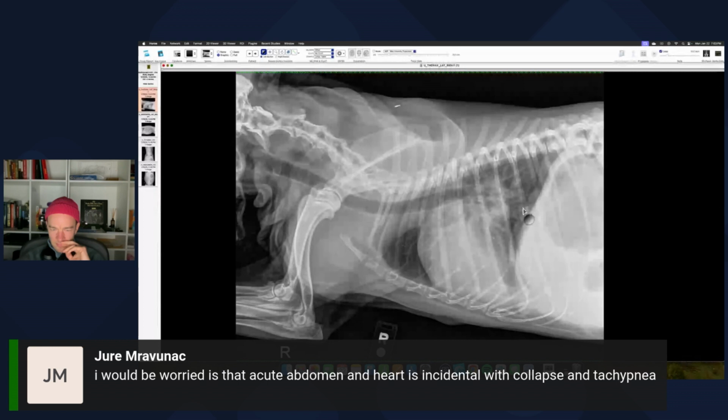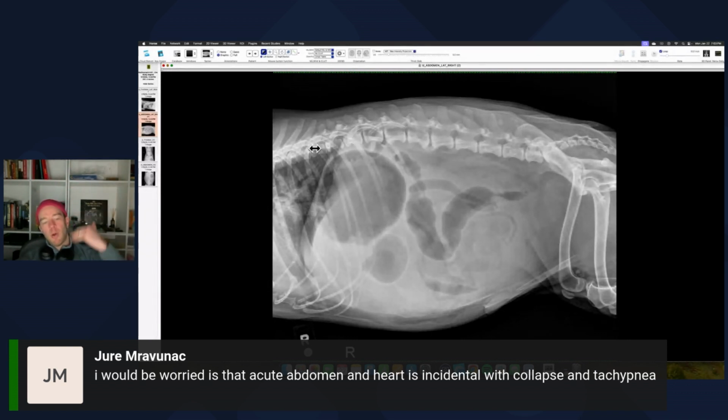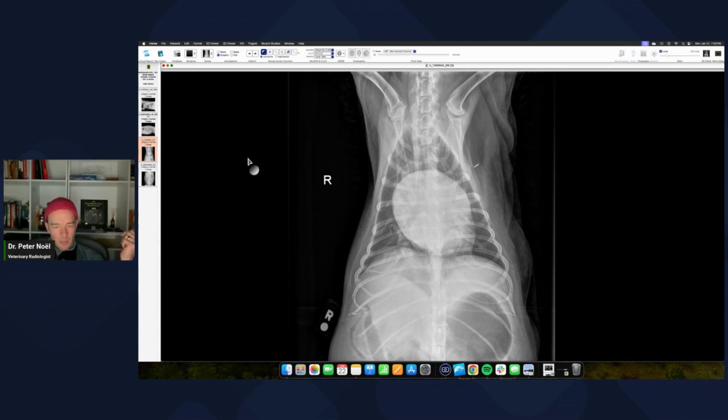So yeah, I think the other thing you can look for is gallbladder wall edema. A lot of times with right-sided or post-sinusoidal, meaning after the sinusoids of the liver, anything in this area causing congestion can cause dilation of the vena cava and the intrahepatic veins, and can cause gallbladder wall edema, not just anaphylaxis or sepsis or hypoalbuminemia. I think portal hypertension can do it as well, but a post-sinusoidal process can do it. But yeah, this is a little subtlety right here.